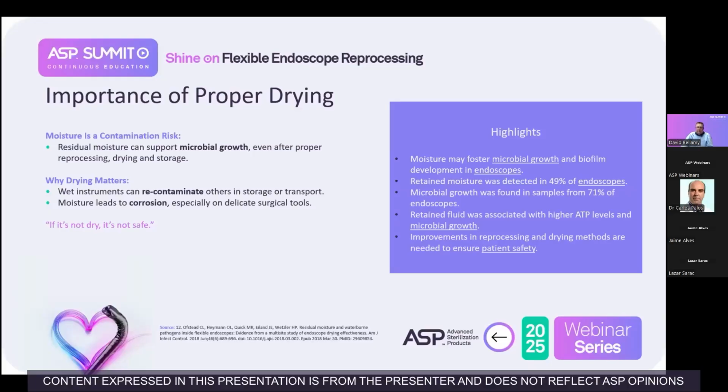AS 5369 aligns with ISO and requires facilities to monitor, document, and validate the drying procedures, particularly for high-risk semi-critical devices. And here is another real-world example, from a hospital with a Pseudomonas outbreak in a healthcare facility in Europe. They discovered that their bronchoscopes were contaminated due to insufficient drying after disinfection, which caused severe respiratory infections in patients.